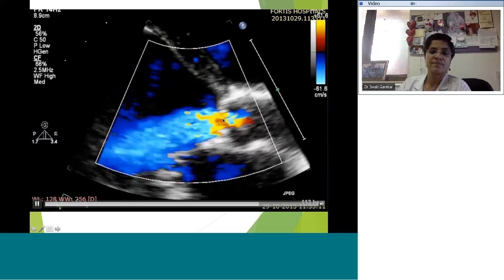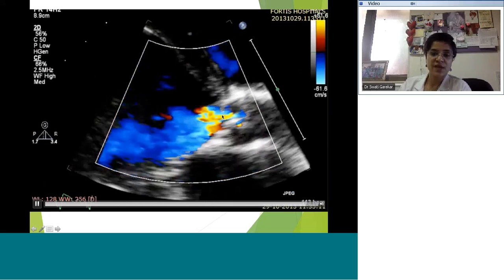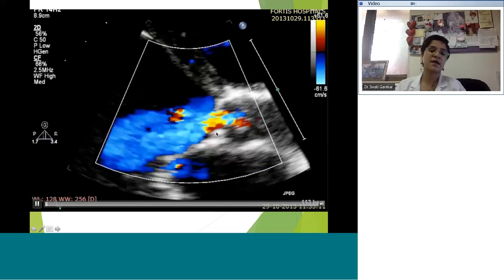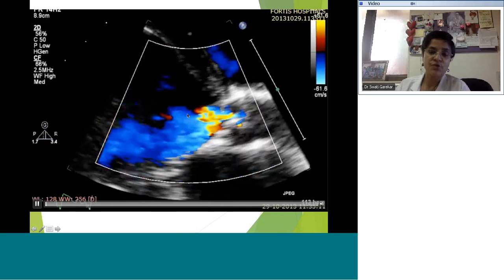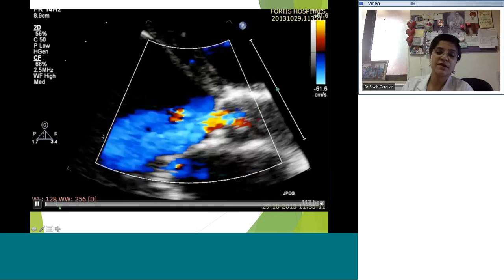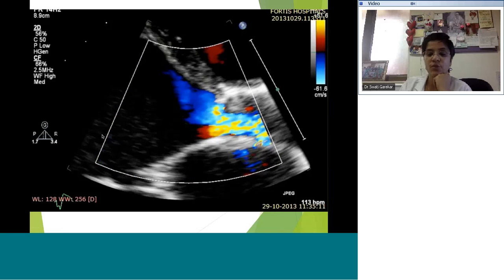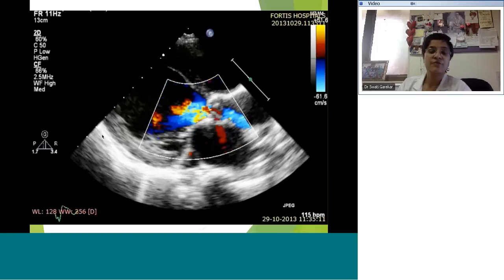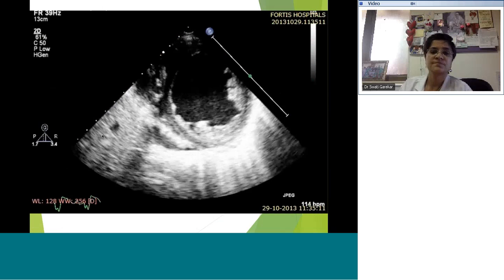Look at the amount of regurgitation — a wide blue jet with a wide vena contracta. To assess aortic regurgitation severity, we compare the vena contracta diameter to the LVOT diameter and plug it into the table. The length of the jet also helps — whether it's just at the cusp, extends into the LVOT, reaches the mitral leaflet, or goes well into the LV cavity. The density of the aortic regurgitation signal on spectral Doppler also helps cite severity.